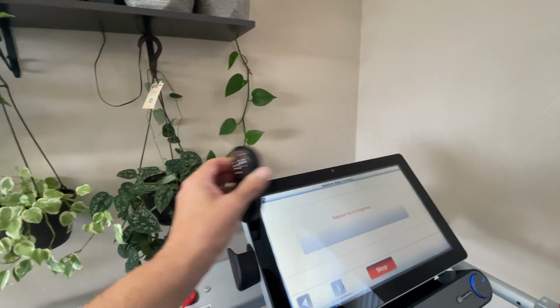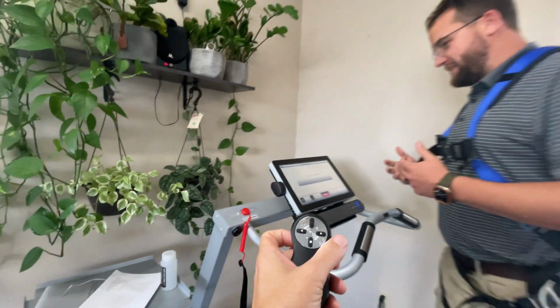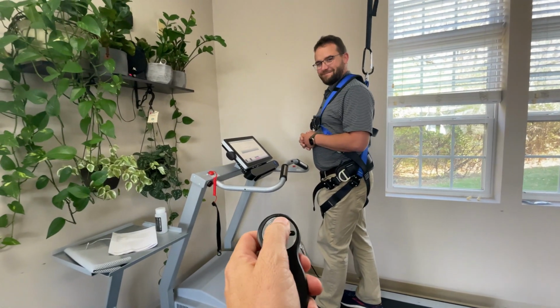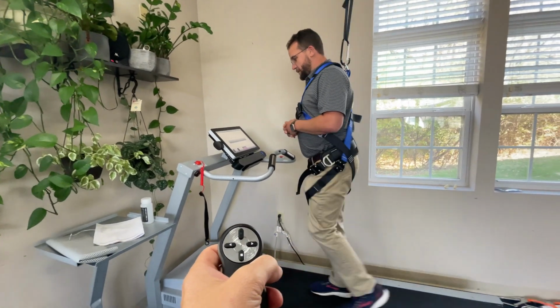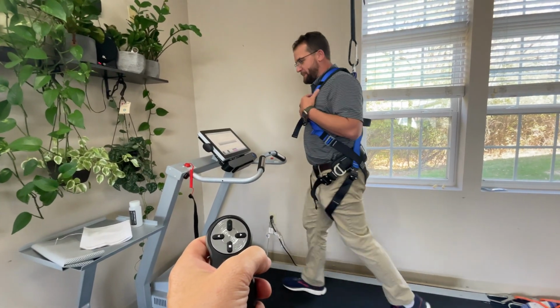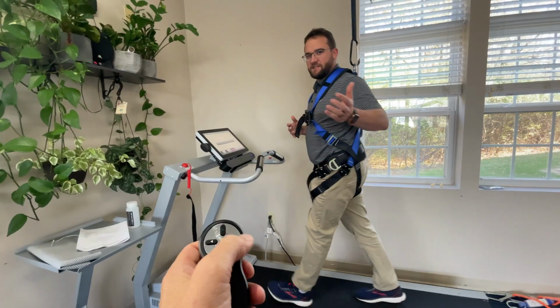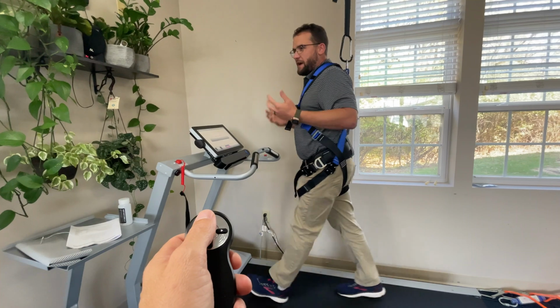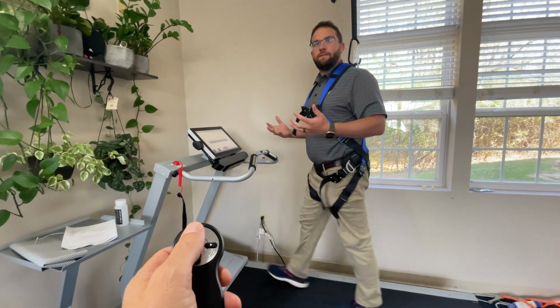Tony is going to grab the remote, and then without me knowing, he's actually going to hit the start button. All right. So now I'm walking, again, 2 miles an hour. I'm safely harnessed in. And this is on demand. As Tony is the clinician, he can maybe join in on a voiceover. But Tony, when you're having somebody on demand on this, what are you looking for?